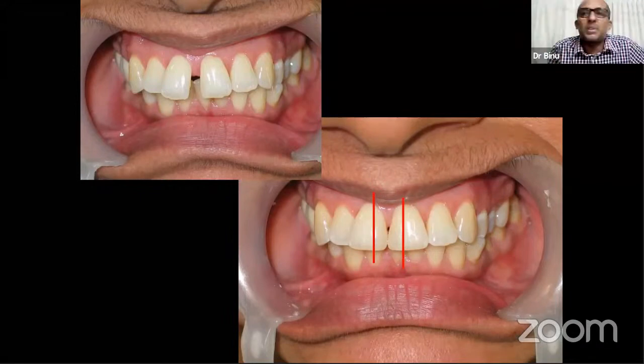That typical question: doctor, will it look wide? If I close that much gap, don't you think it will look wide? It won't look wide. Definitely it's wide, it's such a huge tooth, no doubt about it, but it won't look huge if you look at these simple things in photography, the line of light reflection, and do your composite work. No composite should be bulging out. Everything should go in from that line so that the light gets reflected from that point.